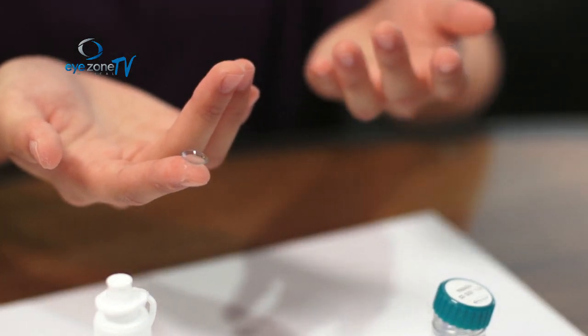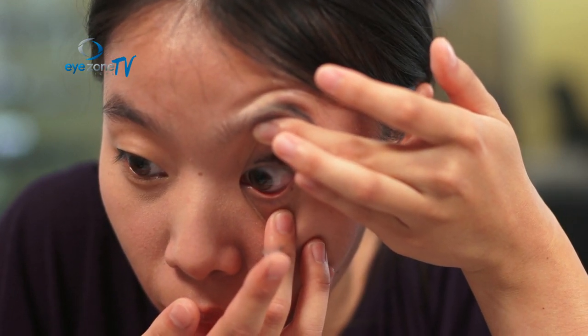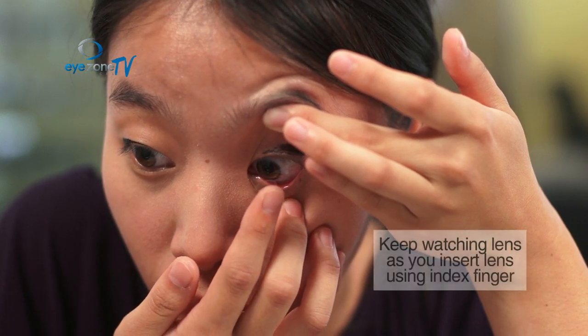Use your middle fingers to keep your eyes open, and now use your index finger to put the contact lens in your eye. Keep watching the contact lens as you place it.